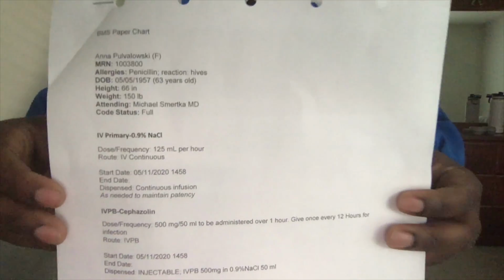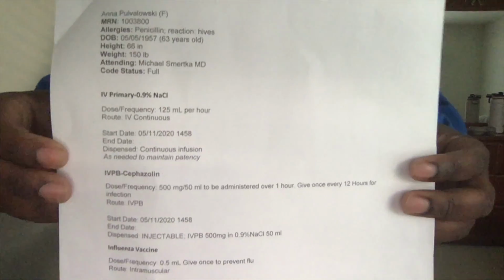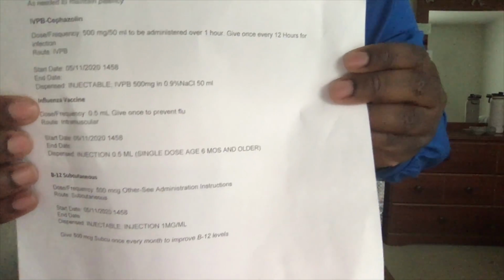Now that I've shown 3 common areas to give an intramuscular injection, I'm going to go into the Pyxis and pull up Anna's MAR so I can give the proper medication. But first, I'm going to hand sanitize. Looking at Anna's MAR, I can see her name, date of birth, and her allergies. Now, I'm going to peruse the entirety of the MAR until I find the medication that I'm looking for. And here it is, influenza vaccine.